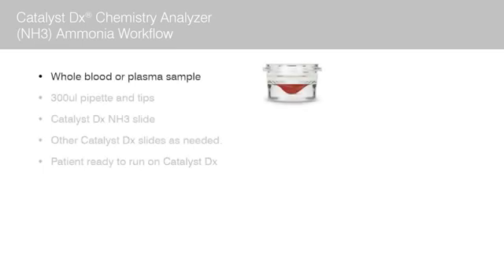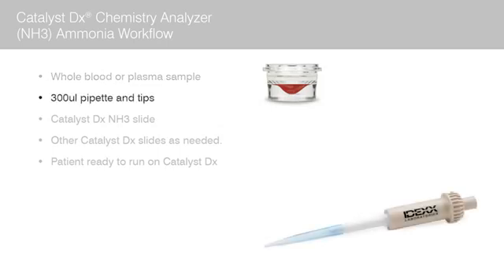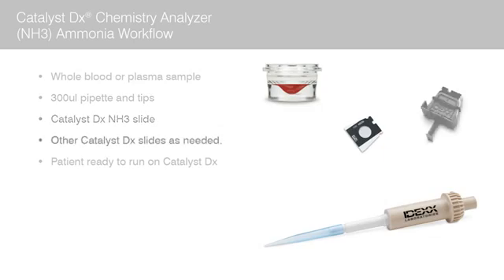A whole blood or plasma sample, a 300 µL pipette and tips, and a Catalyst DX NH3 slide, which may be run with all other slides.